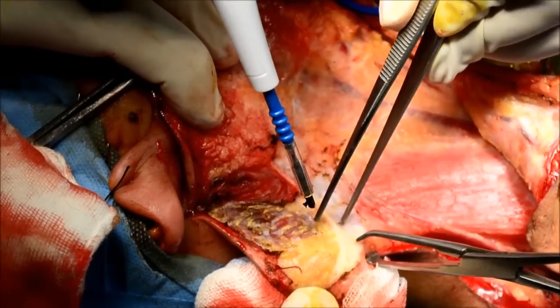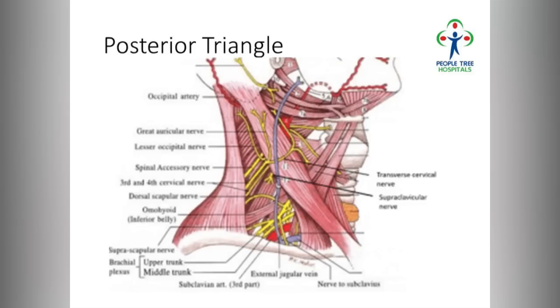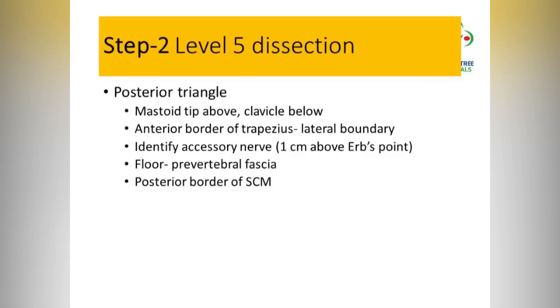The posterior flap is the difficult flap to raise because you do not have the platysma. Care should be taken about the accessory nerve. To identify the accessory nerve, use the greater auricular nerve as the landmark — where it encircles the sternocleidomastoid muscle, within one centimeter you should find the accessory nerve.